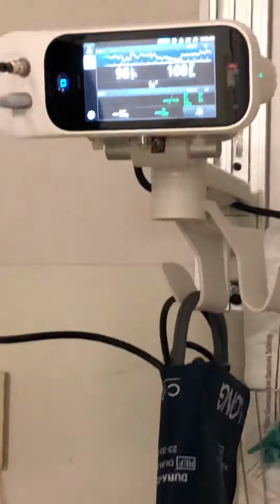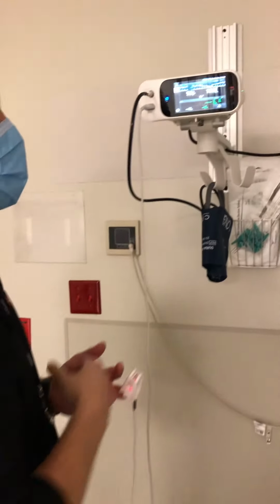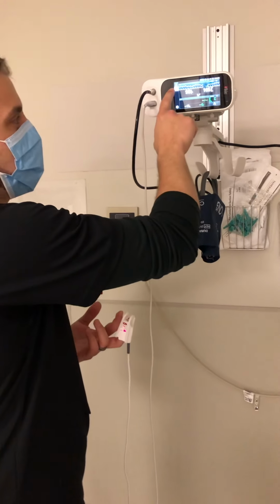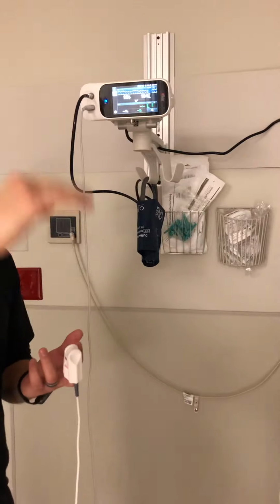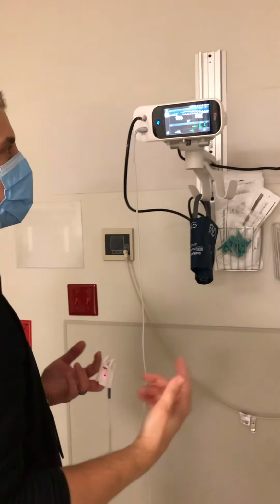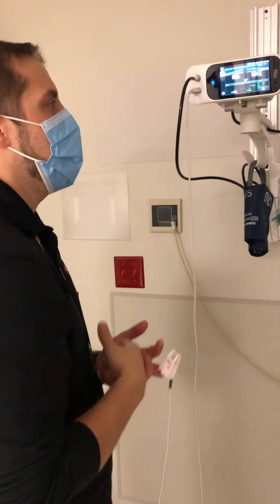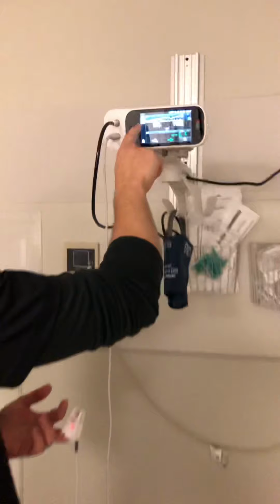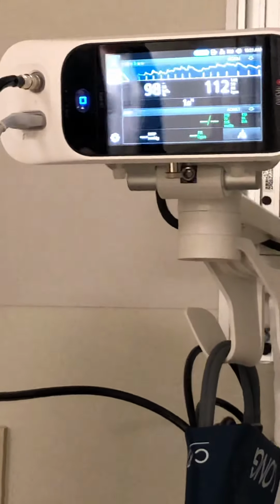But when you're looking for confidence in your signal for SpO2, typically we're taught in respiratory nursing school that if you have a nice even pleth waveform, tall white spikes, that's when you know how to trust your saturation percentage, right? It's not so much the case with Masimo. Masimo technology can read through motion and low perfusion. So yes, if you have a nice clean pleth waveform, that is a great indicator.